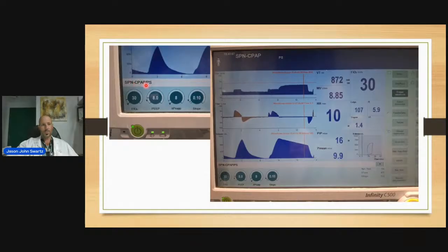This is to show you. So here's pressure support ventilation, 8 and 8. You see that here it's reaching 16. You would think, oh okay, well, that's it. There's nothing more than 16 of peak pressure being generated, since it's 8 and 8.